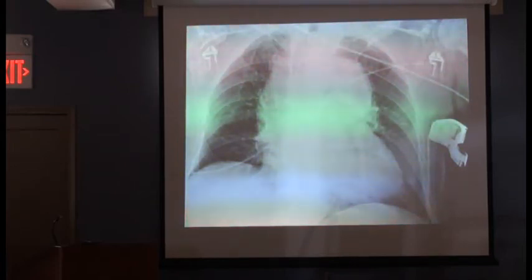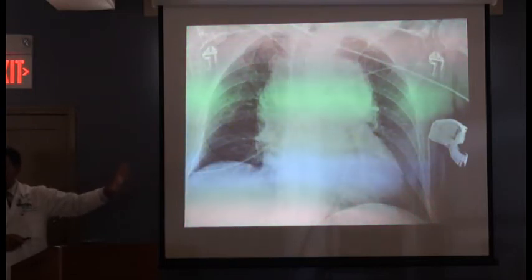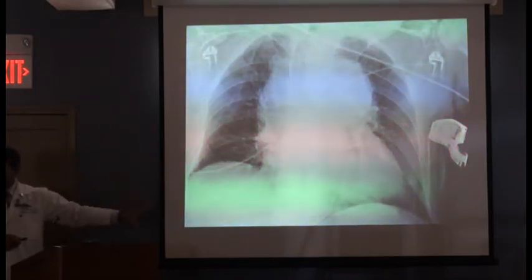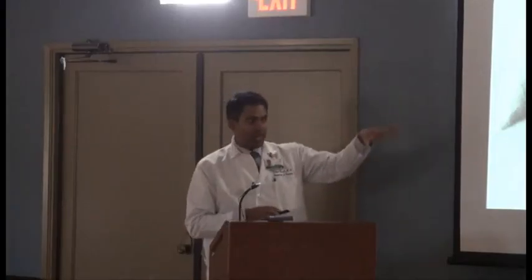If I told you this patient had a head-on MVA, see, this is a problem. I see this, it makes my night so much longer because now I got to get a CT angio, and now we got to stabilize the patient in the ICU, and I just want to go back to sleep sometimes. But if they're stabilized, it's not that big of a deal, right? Because we can wait. We don't have to rush and operate. Get the blood pressure under control, assess other injuries, make sure there's no intracranial hemorrhage, see if this patient can get an endovascular technique versus an open. So we've got time to play.